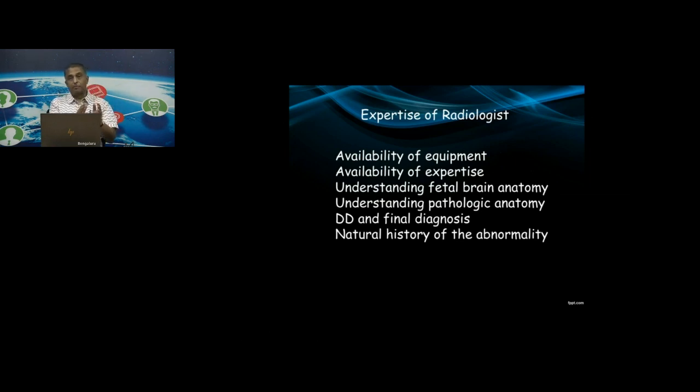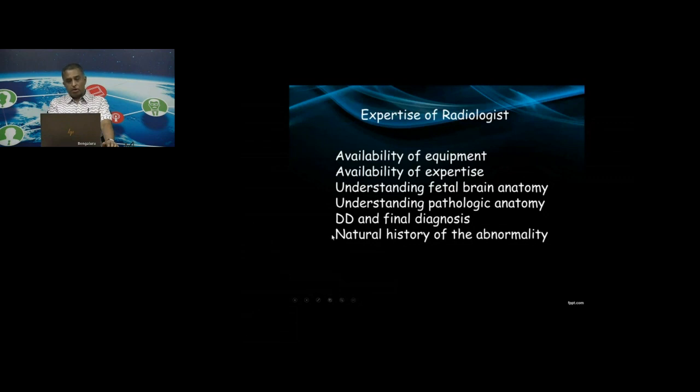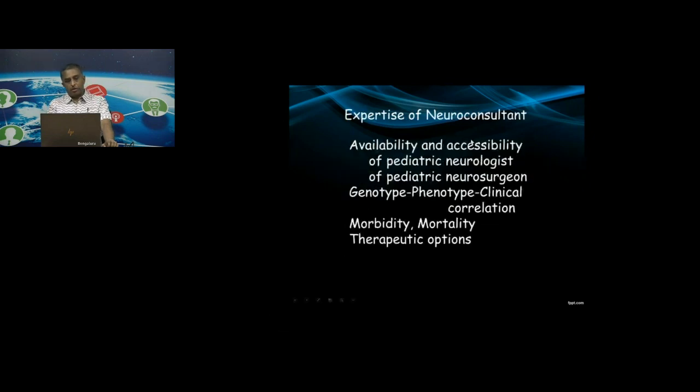How does a picture, whatever section it is, whatever modality it is, how does it differ from normality? And having put together all the abnormalities that have been picked up on these images, have a differential diagnosis in mind, get up to the final diagnosis, and also have a good insight into what is the natural history of the abnormality.